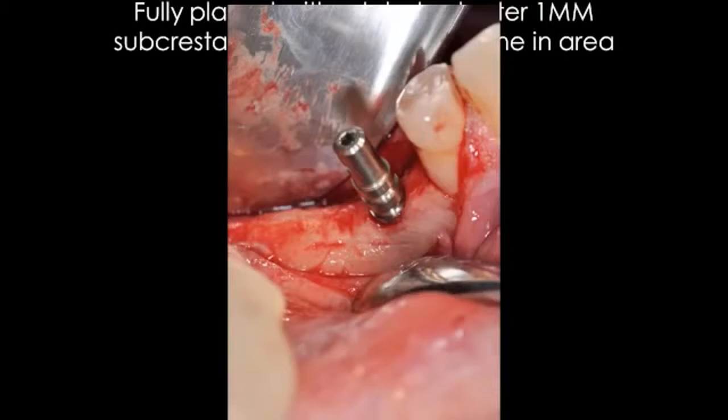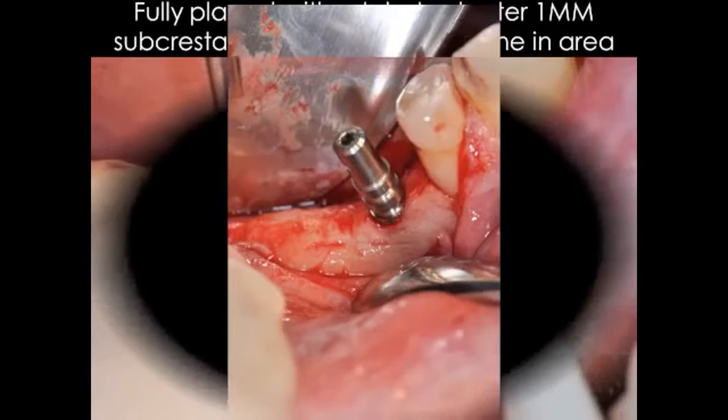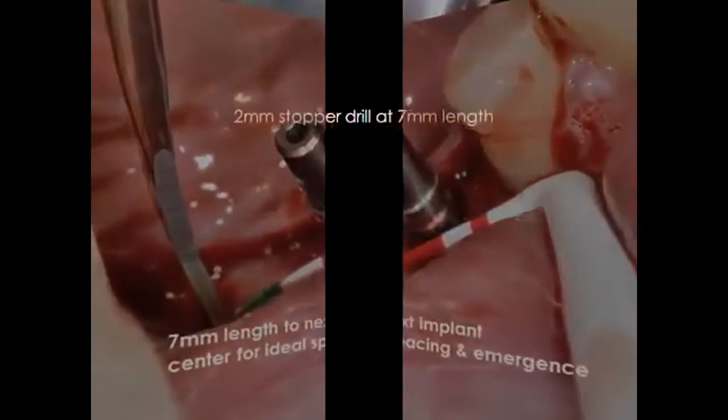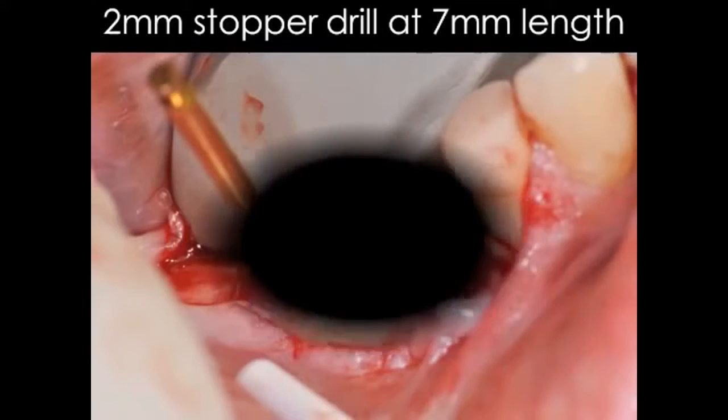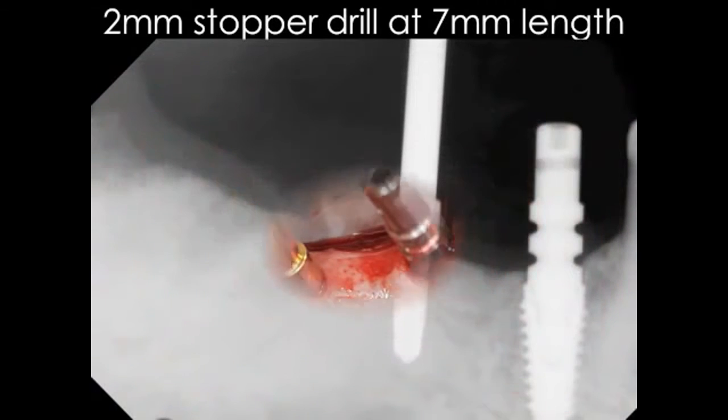And now this is a really nice pathfinder that screws into the implant once your implant is in place. You can utilize your pathfinder for future placement and for checking your parallelism at every chance you can. Again, the 2 millimeter stopper drill at what length? 7 millimeter length. To just note where we are, take an x-ray, and so forth. We're going to proceed with the case.